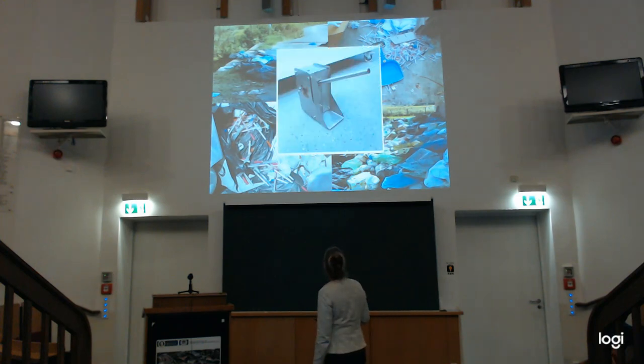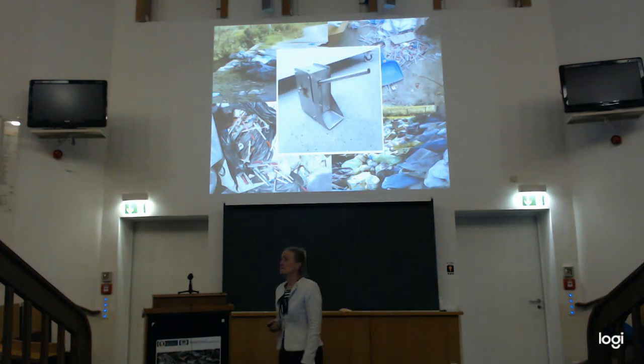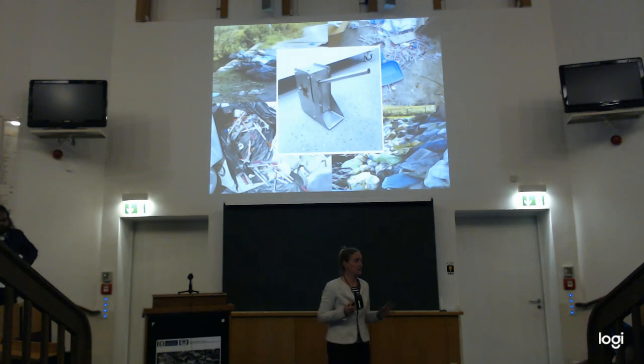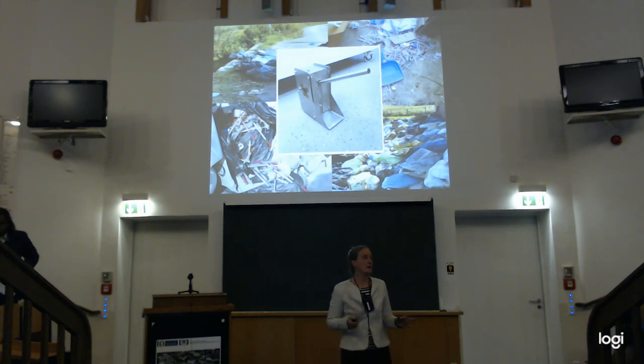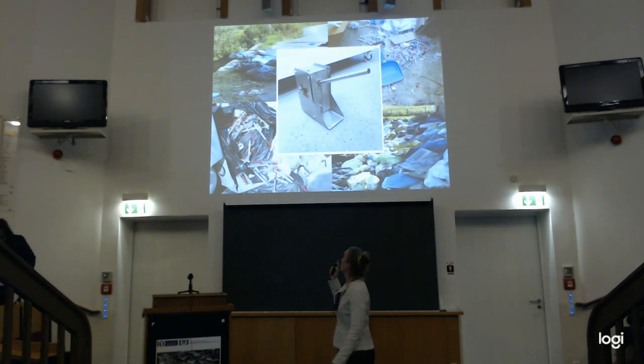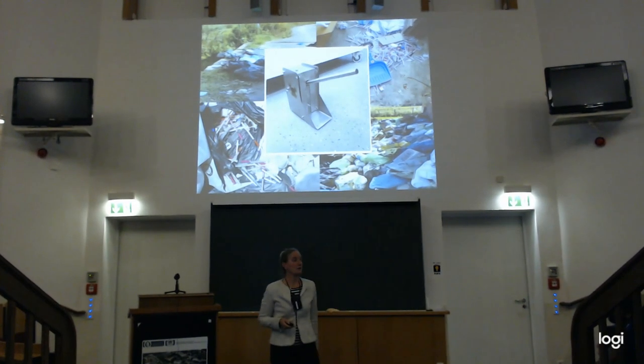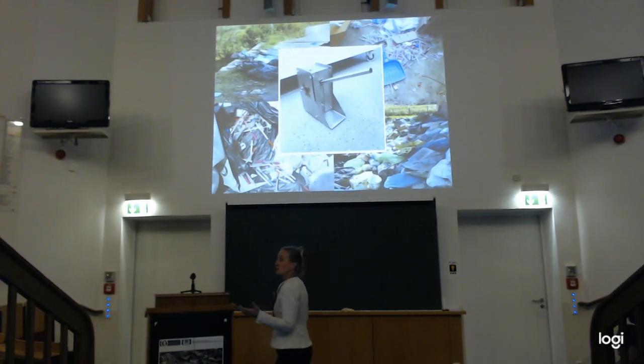So a question came up: we have a needle cutter. It's something that we do not use, but a needle cutter is something they can use, because they do not want the needles to be used again. So maybe after use, the needle should be cut. This needle cutter was developed by one student recently, to see if it works.